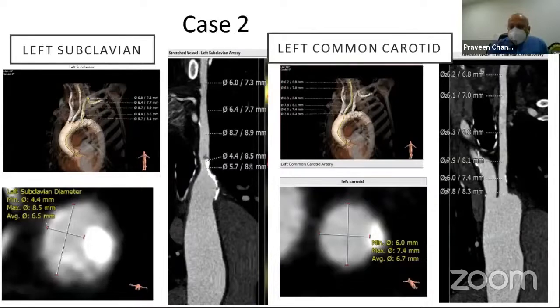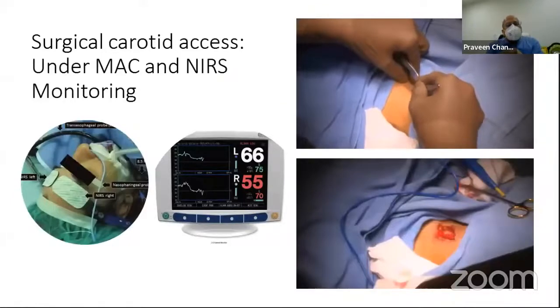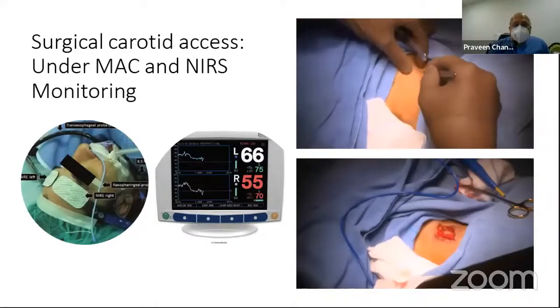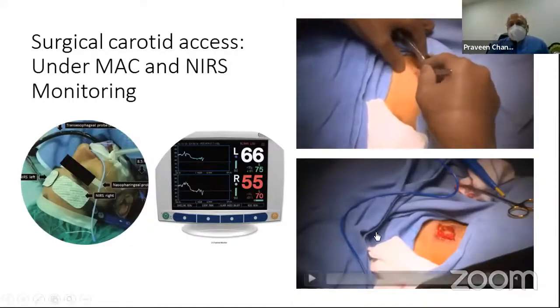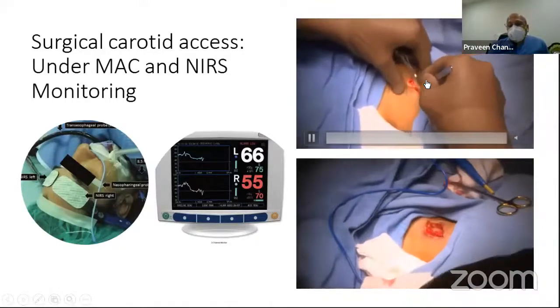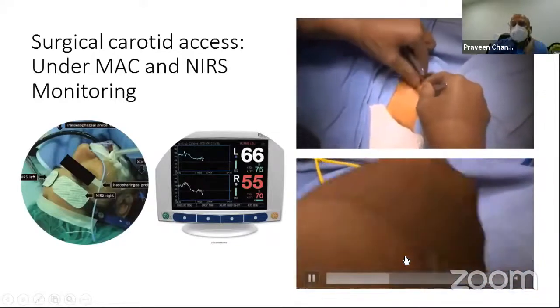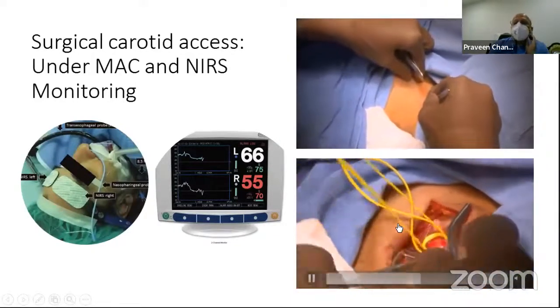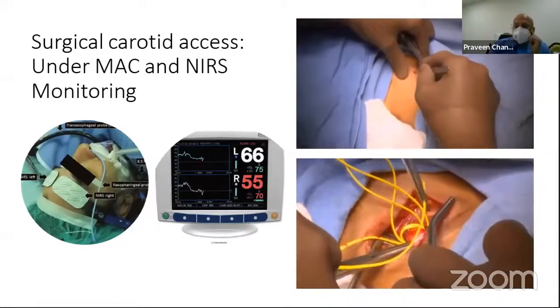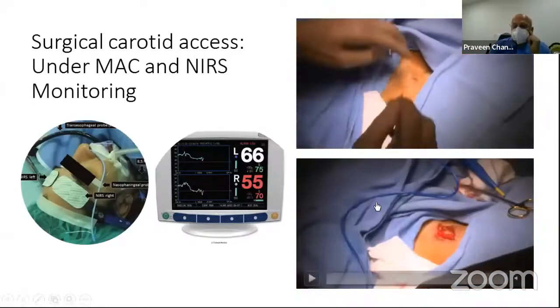And we have done several cases through left carotid access, which is also quite simple and easy. Again, here the patient is, as you can see, under MAC and INVOS monitoring, which we do continuously. The anesthetists do that, and it is an open approach again. Our vascular surgeons and cardiac surgeons are both very experienced in opening the carotids, because it's very straightforward, simple. And now we do it without even general anesthesia. We do it locally, because they do local carotid endarterectomies many, many times. So here you can see that it is a local carotid access.